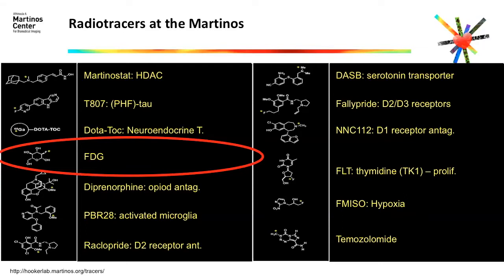It is basically a glucose analog. What we are doing is using glucose and changing it to use one of these positron emitter nuclei, which in this case is an F18 radiotracer. That glucose is going, for instance, to interact within any live cell in the body.